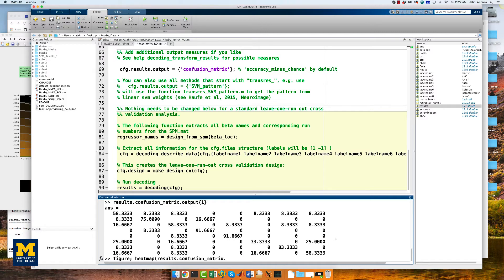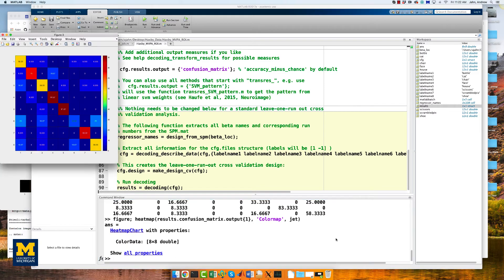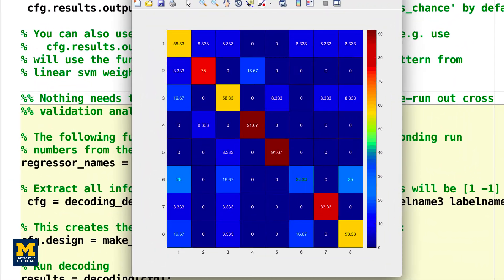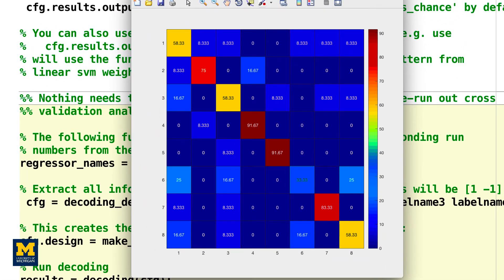You can also represent the confusion matrix as a heat map using the heatmap command, which may make it easier to visualize and more similar to publication figures. Going from left to right and top to bottom, the columns and rows represent the conditions: bottle, cat, chair, face, house, scissors, scrambled pics, and shoe — in the same order they were entered into the GLM.